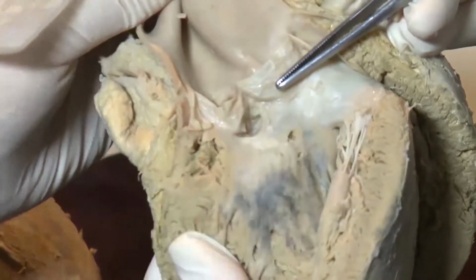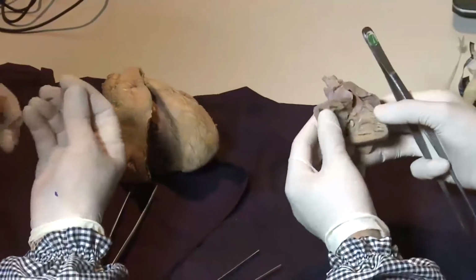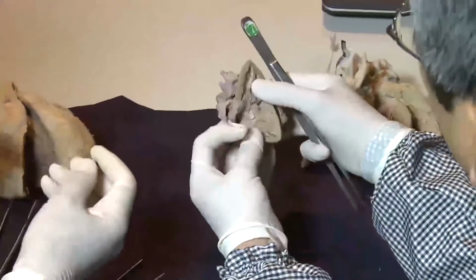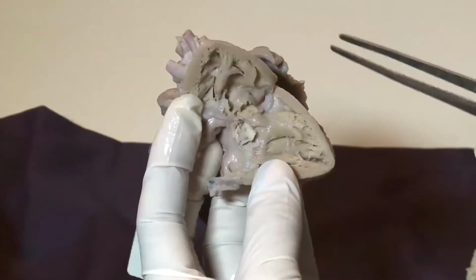Okay, we can see another specimen using a VSD patch. This is a patient who had surgical closure of VSD before.